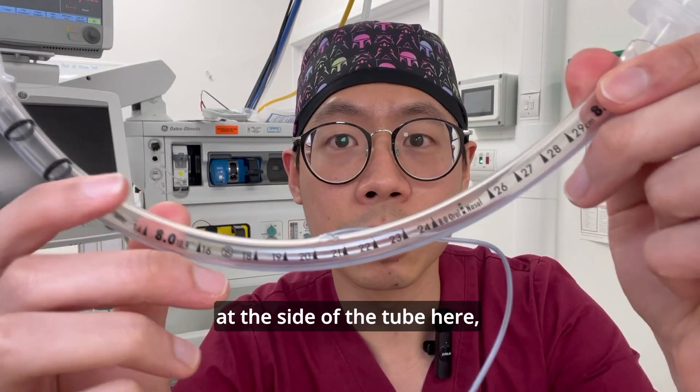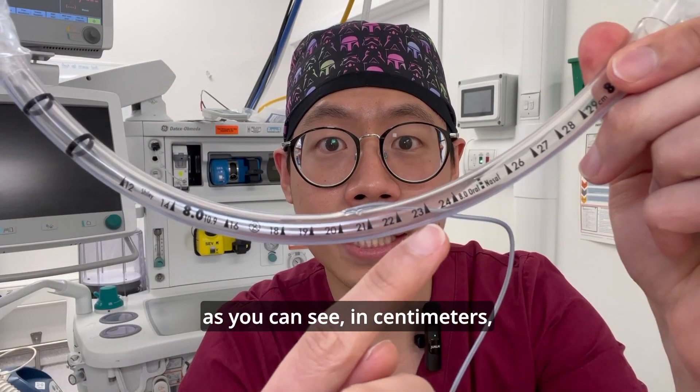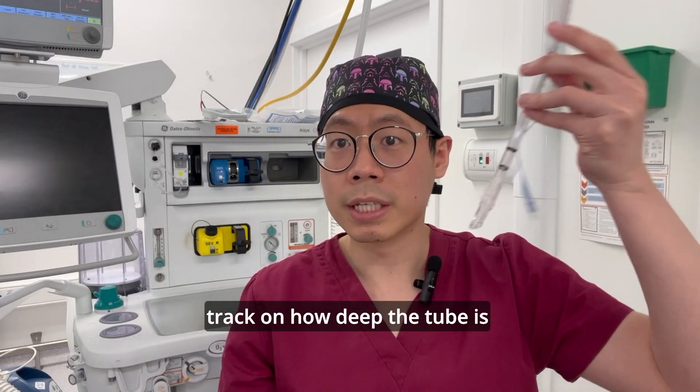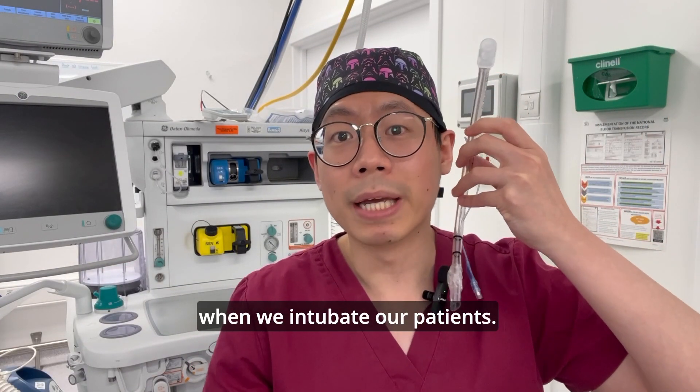There are also markings along the side of the tube here in centimeters, which allows us to keep track of how deep the tube is when we intubate our patients.